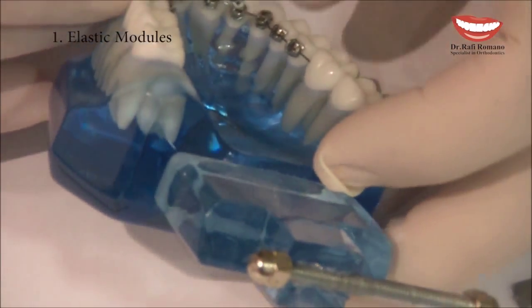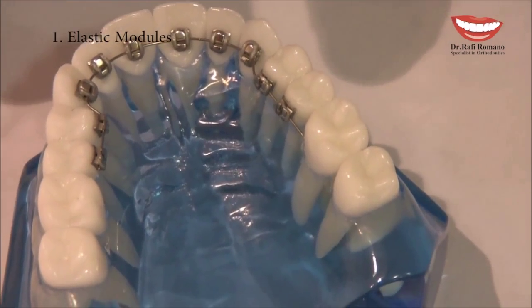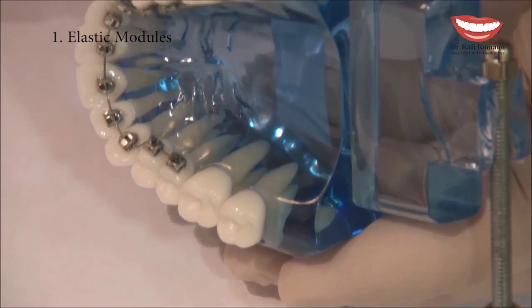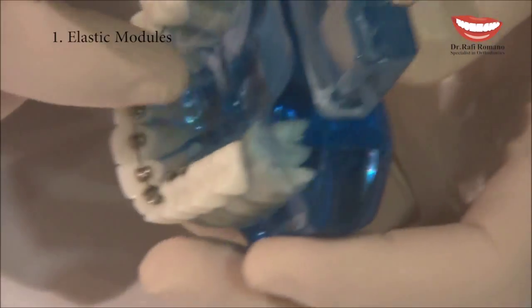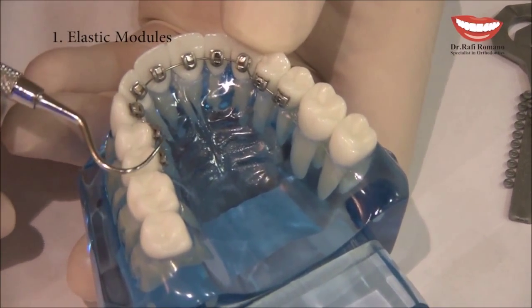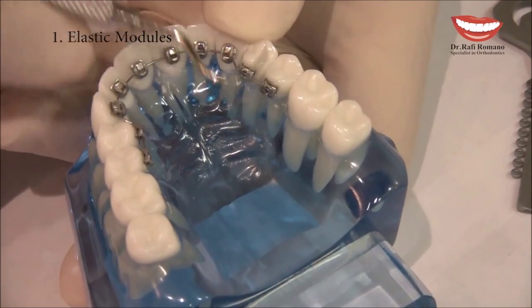Going back to the premolar — there are two wings, one mesial and one distal, so I can decide to tie on all four wings, or only on the mesial or only on the distal. Once I've completed the ligation, I can use the distal cutter, but even when cutting close to the bracket there is still a small wire extending distally to the terminal bracket. This wire will definitely poke the patient's tongue.